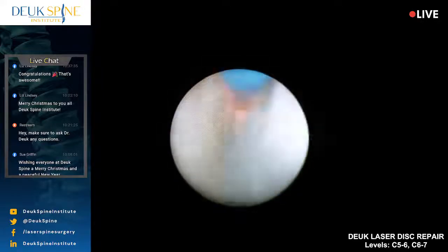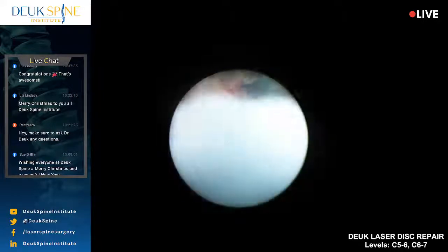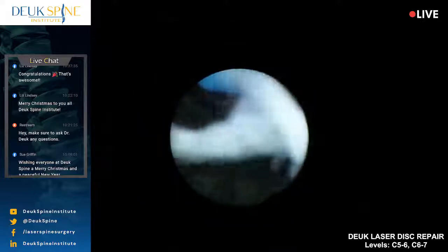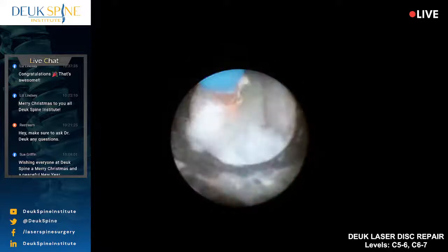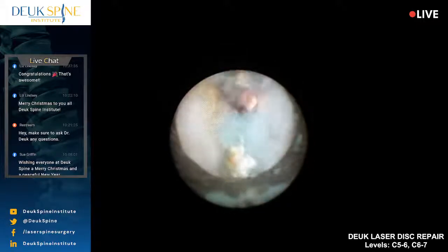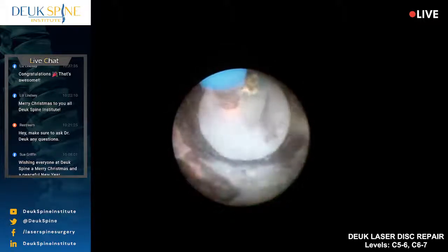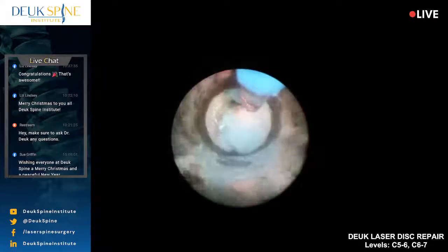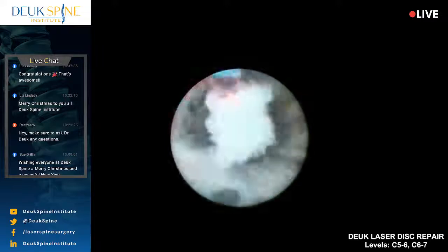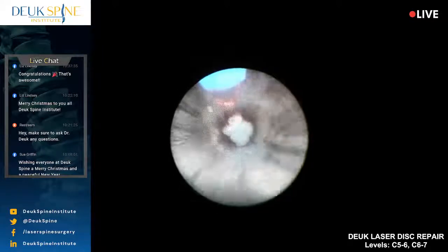And oh, look at that herniation. Another herniation coming out. Just so many pieces of herniation. And a lot of them are collagenized, meaning they've been worked over by the inflammatory system of the body. That's a big one right there. I'm going to get it out right there. Oh yeah, baby. Don't you love it when a plan comes together?